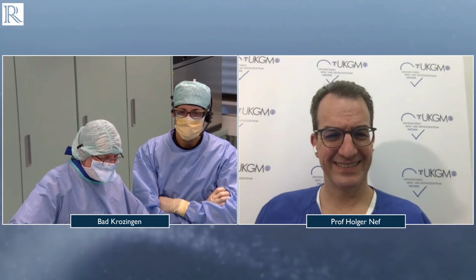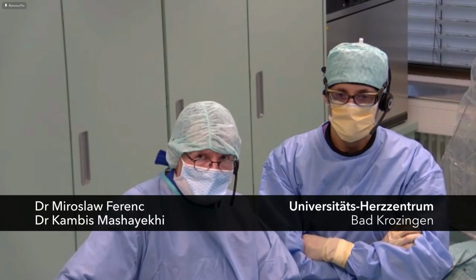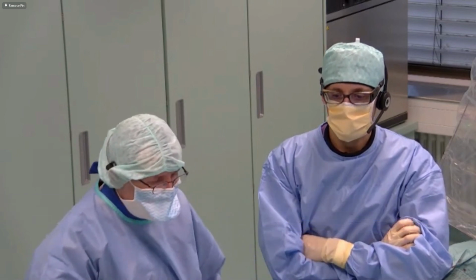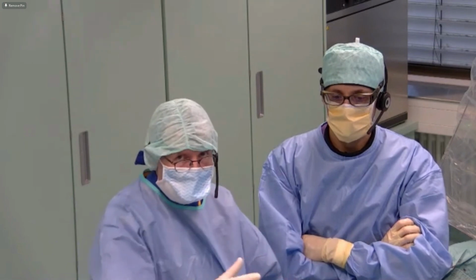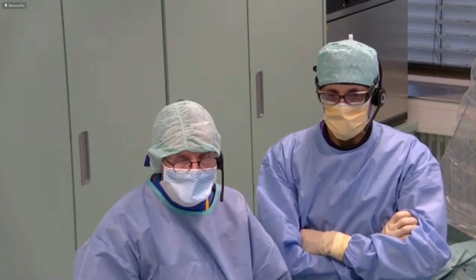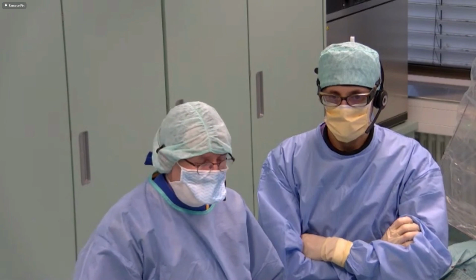Yeah, Holger, we do a lot of bifurcations. Every day we have to treat bifurcation lesions, and the huge benefit regarding lesion preparation in calcified bifurcation lesions is the fact we can leave the wire in the side branch in position, so we can go safely with the IVL balloon to the main branch or whatever. The other wire can stay in position. If we rotablate, we have to remove the side branch wire or main branch wire, and this is sometimes a critical point.